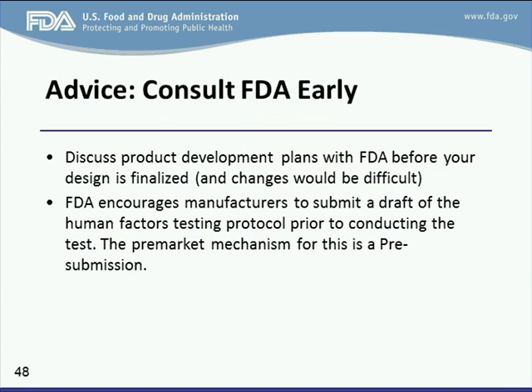So I would like to conclude by saying that you are highly encouraged to engage the CDRH in your product development as appropriate, so that appropriate human factors data will be submitted for a pre-market review.